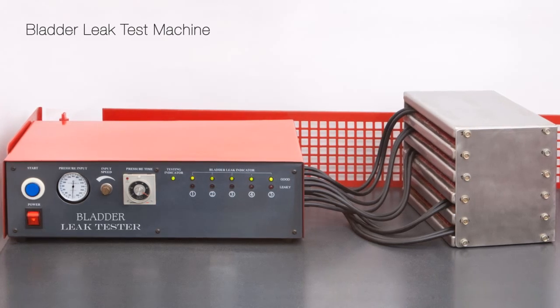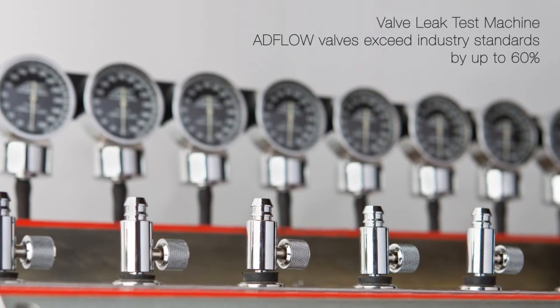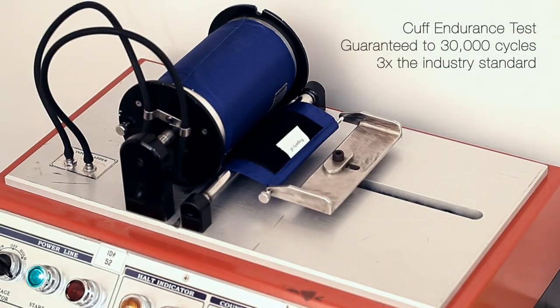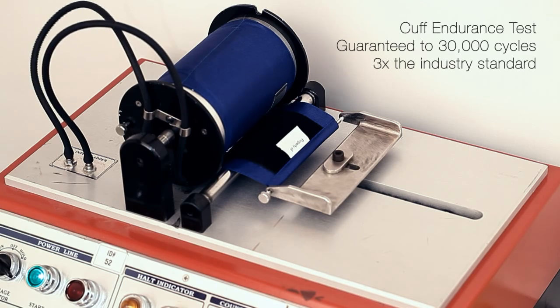ADC employs proprietary test equipment to ensure each of the inflation system components meets or exceeds international and even more stringent ADC performance standards.